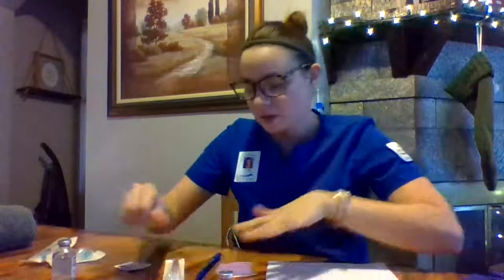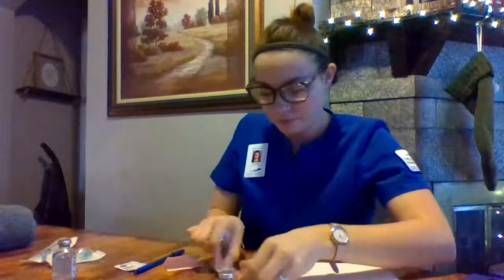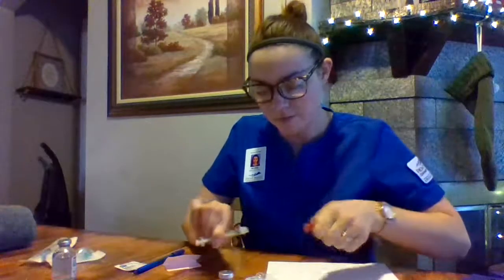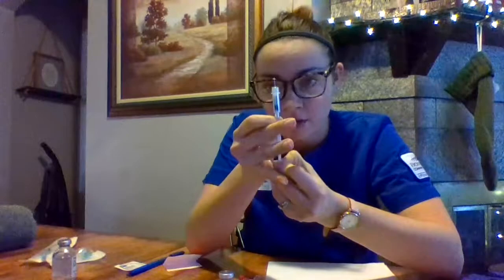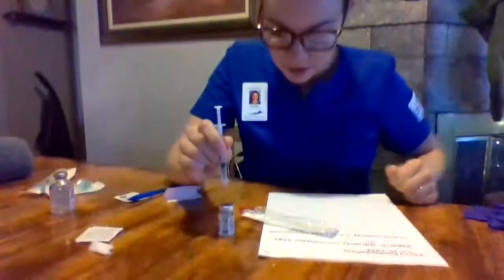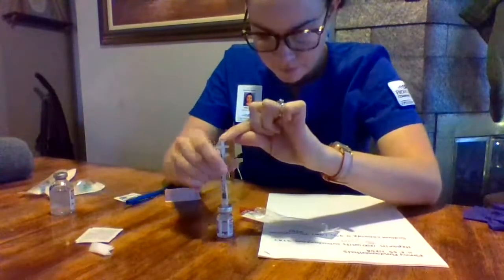Okay, and I'm going to get out my syringe, loosen the top, draw up some air. I'm going to draw more air than I need so that I can get out my bubbles. Then I'm going to inject that air into my vial and draw up my medication.